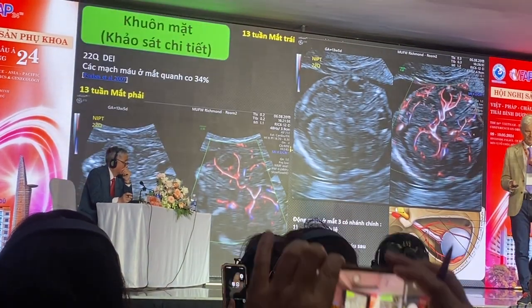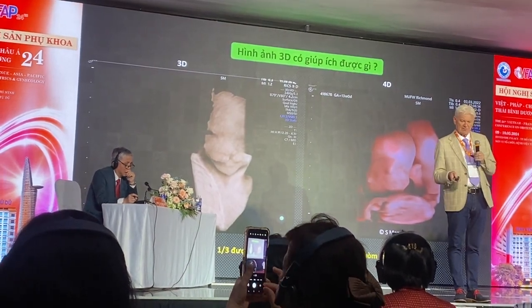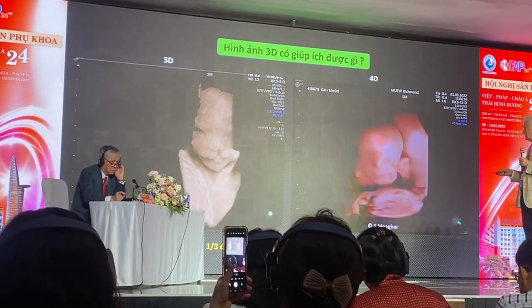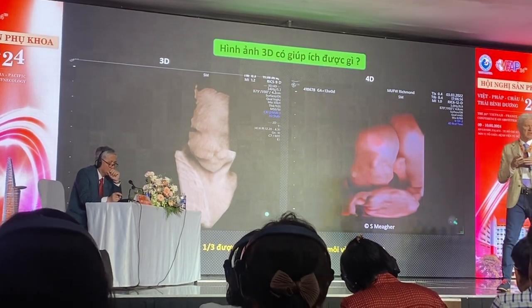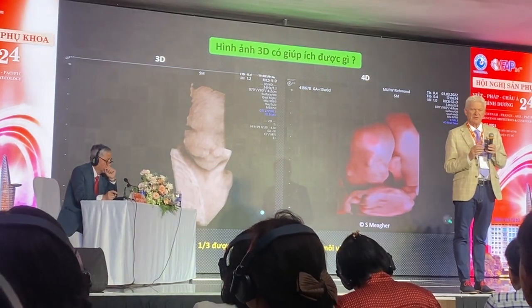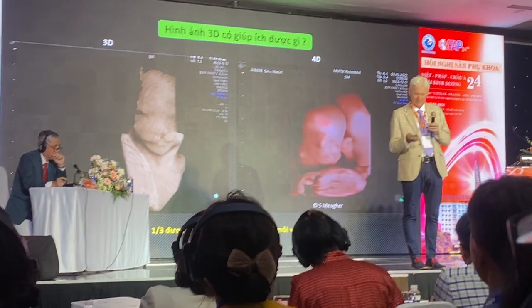In this case here, on the left-hand side, you may appreciate the baby has a unilateral cleft lip. The palate is intact. And this shows you a video clip, shows you on 4D. The lips are not fused at 13 weeks, they are open. And if you look with 4D with the cleft, you can see the baby's mouth opening and identify the cleft.